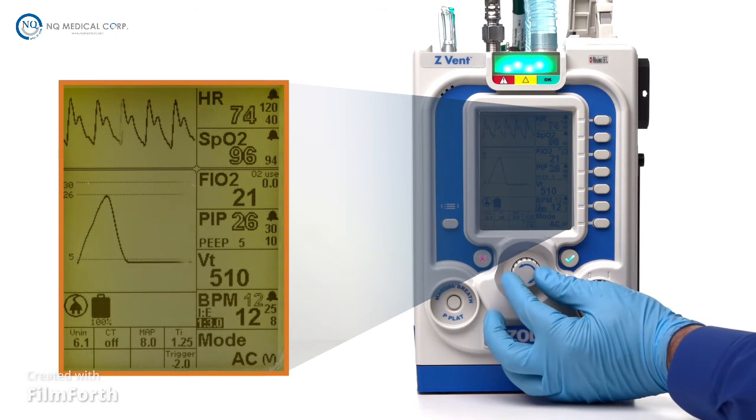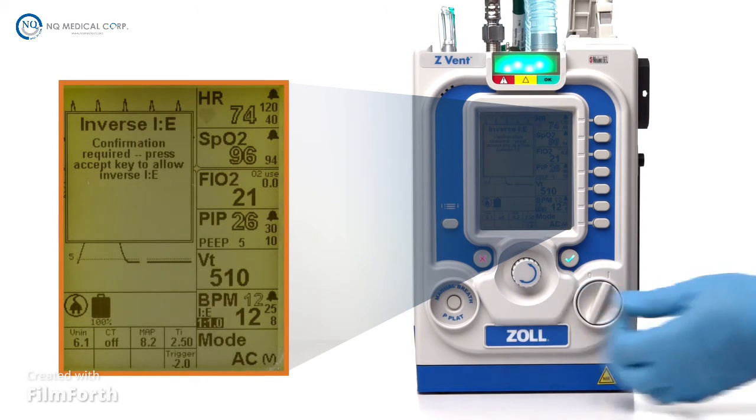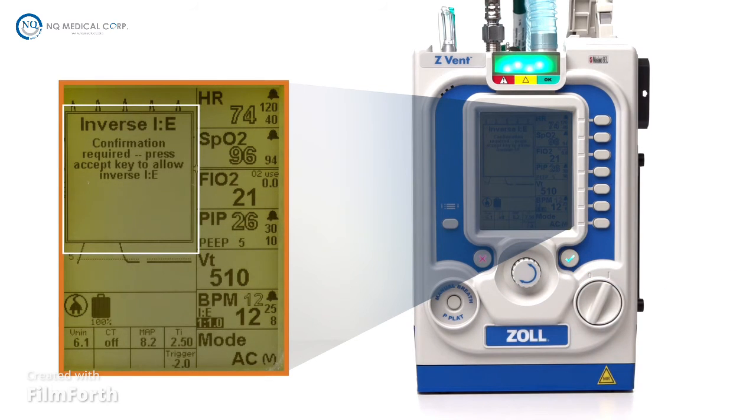Using the selection dial, turn the dial counterclockwise to lower the ratio. If you attempt to scroll lower than a ratio of 1 to 1.0, a pop-up window will appear over the waveform window that asks you to confirm if you would like to inverse the I/E ratio. Confirm the pop-up prompt by pressing the Accept button. Continue to use the selection dial to set the desired inverse I/E ratio and confirm the change with the Accept button.